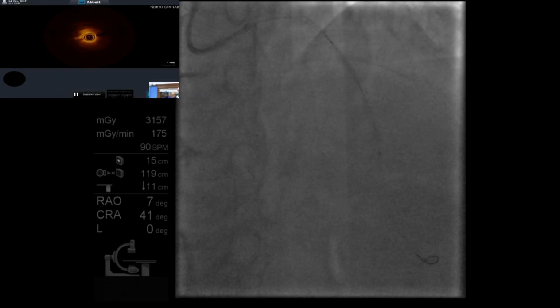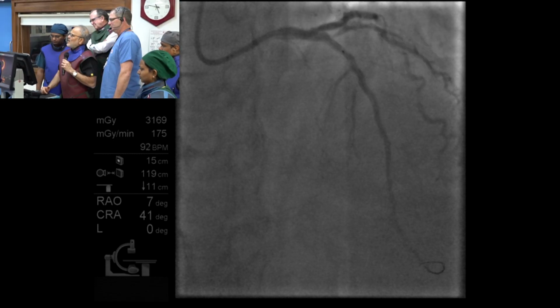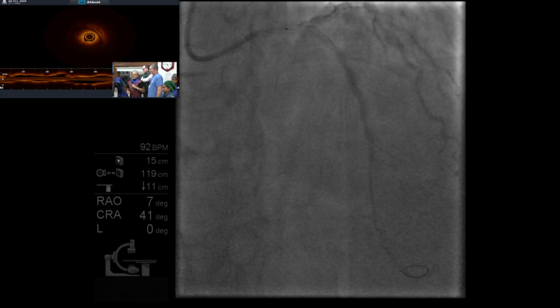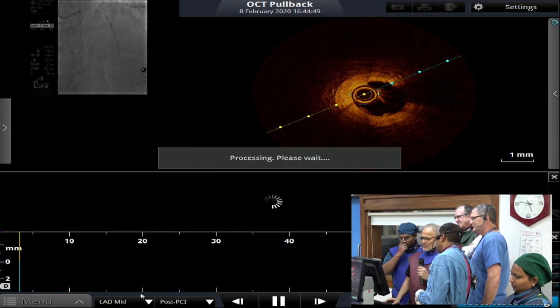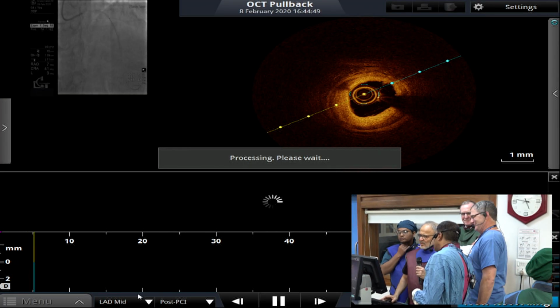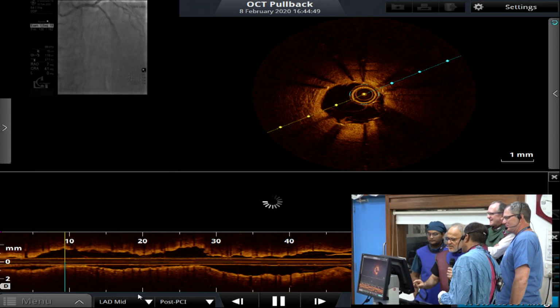Fluoro. Inject. There you are, you're going to have a great image. You haven't interpreted it yet? Speed reading. Yeah, that's it. You can tell he's good, done very good, he's got the interpretation. See, this is the perfect image.